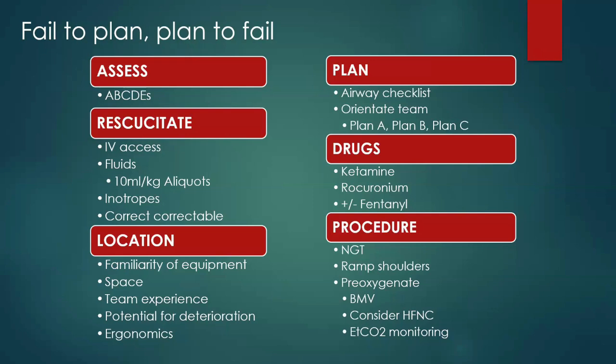And then also to pre-oxygenate these patients as much as you possibly can, whether this be with the bag mask ventilation. Consider high flow nasal cannula as well for these patients if you have it available, and also apneic oxygenation whilst you're intubating with some degree of nasal prongs or high flow. And then also to remember to start your end tidal CO2 monitoring as soon as possible. Not only will it give you information on your success with the intubation itself, but if you do have a situation where there is some form of cardiac arrest, it might be one of your first parameters that you will see and be able to pick that up. And also any problems with bronchospasms or laryngospasms, anything like that.